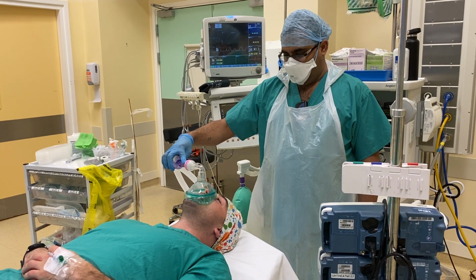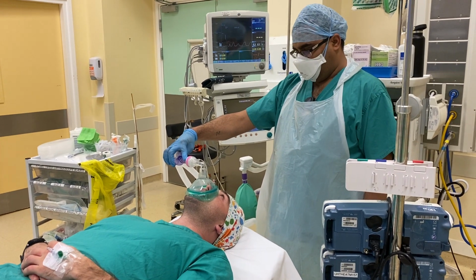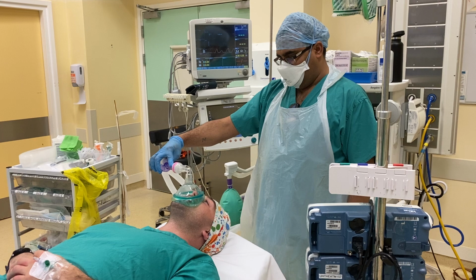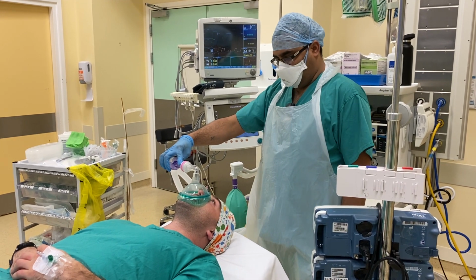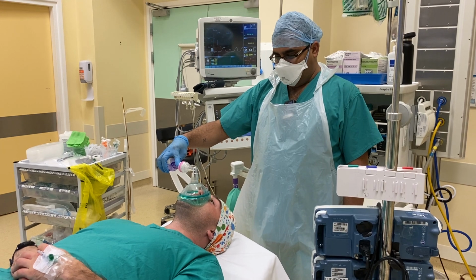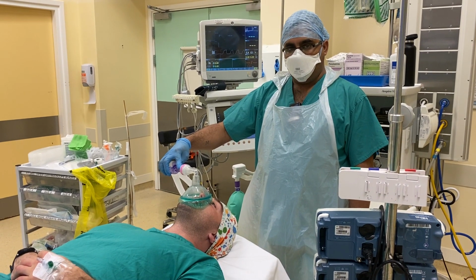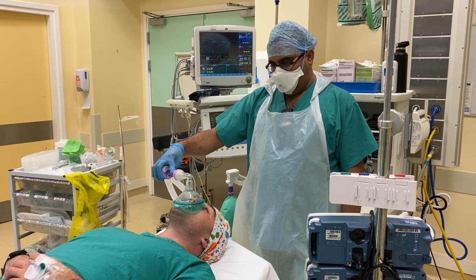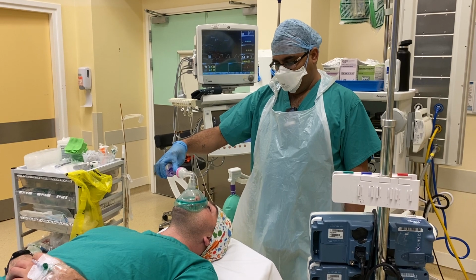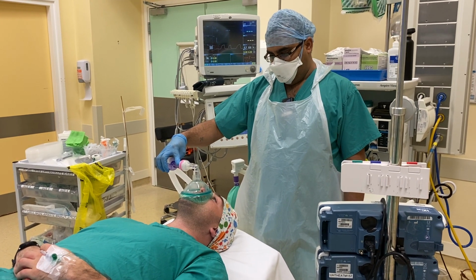Now, when you come to us in the operating theatre, you'll hear us talking about pre-oxygenation quite a bit, and this is important. We want to get lots of oxygen into somebody's lungs before we stop them breathing, before we give them an anaesthetic. If we have any difficulty in getting the breathing tube in, we want them to be full of nice, delicious oxygen in their lungs so that they have got many, many minutes, up to 7 minutes of apnea before they start to desaturate. So you can see that Kumar is holding a mask here over Irla's face.